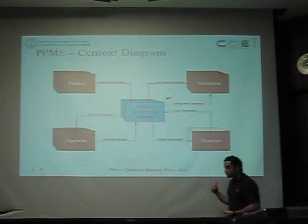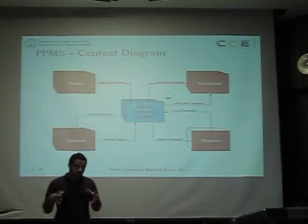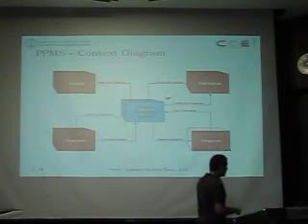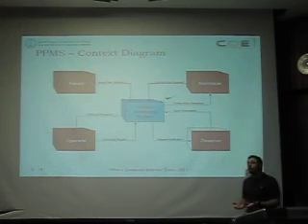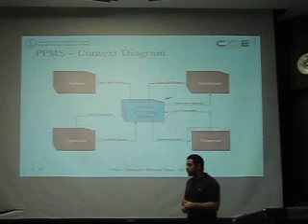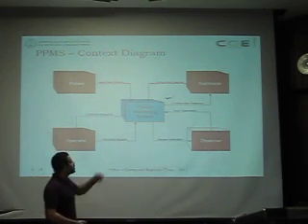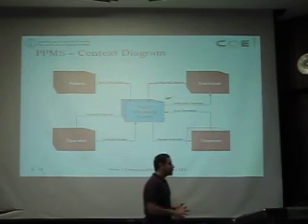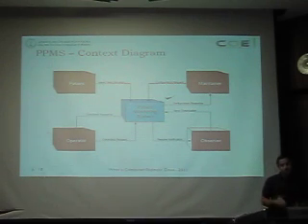And we have the observer. This user could be a doctor or a nurse that observes the patient. And the observer can, of course, send observation notes to the central station. And we have finally the maintainer. The maintainer is the user who configures and fixes the problems of the patient interface unit and the central station.